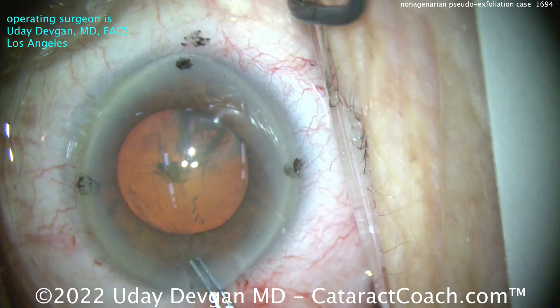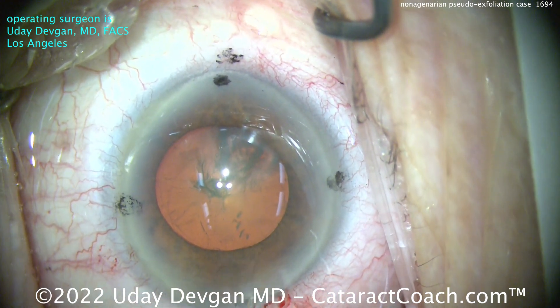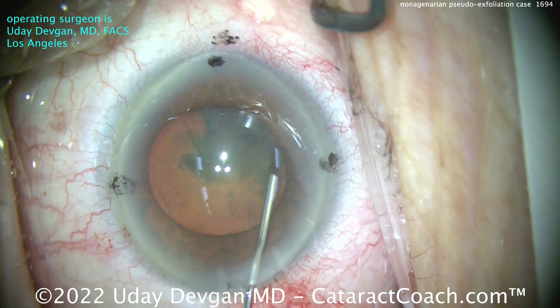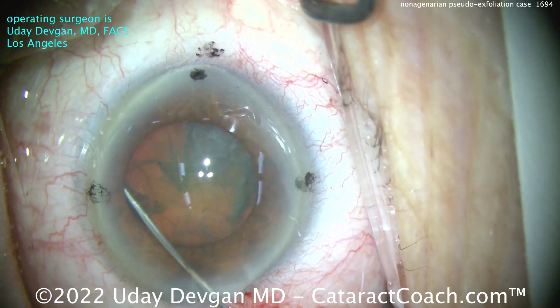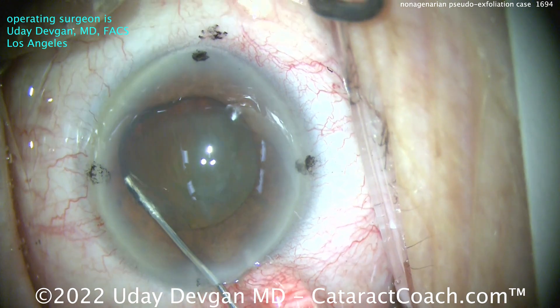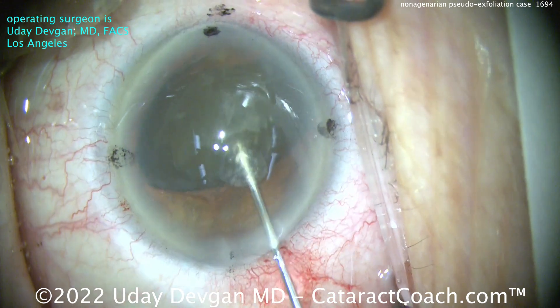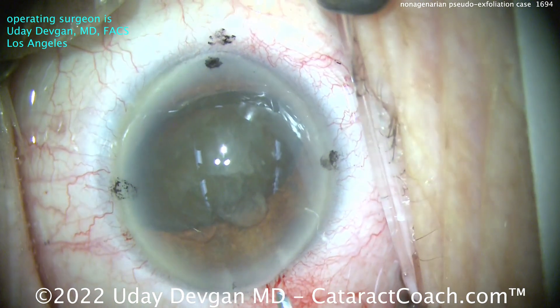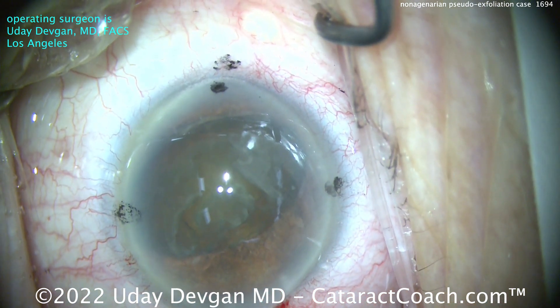Now, in a case like this, the iris is going to come down — it's not going to stay like that. Fortunately, we did check the endothelial cell count at the beginning of the pre-op exam, and the patient had a nice normal endothelial cell count — actually pretty darn good for age 90-plus. Now doing some hydrodissection here, nice and slow. Look at the viscoelastic coming out of the main incision; that just tells me I've got to put in more. Using that cannula, get that nucleus up. A little more dispersive viscoelastic to protect that central corneal endothelium.